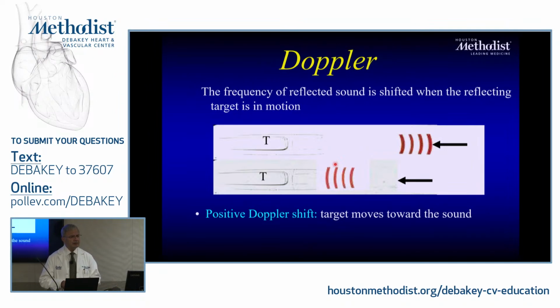Now, what is the Doppler effect? The Doppler effect is there's a certain frequency that's being emitted by the transducer, and there is a motion of what I'm imaging. The motion is changing the frequency of what I've emitted. The interesting thing is that change is much lower. We were talking about megahertz for ultrasound. This is kilohertz. That's why I hear it. It's in the audio range.